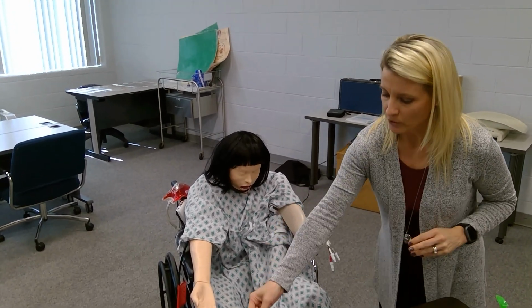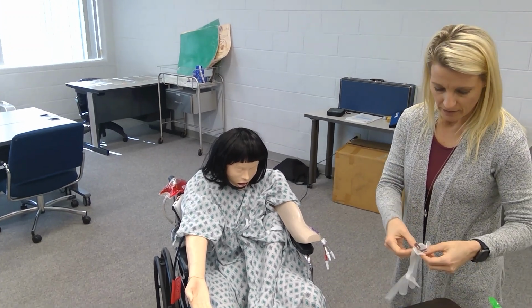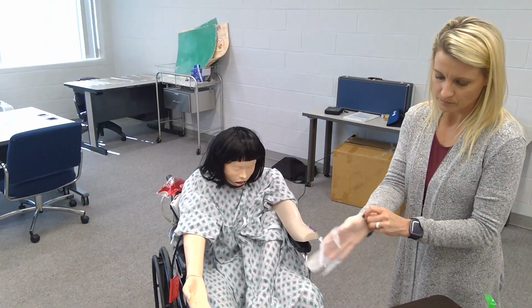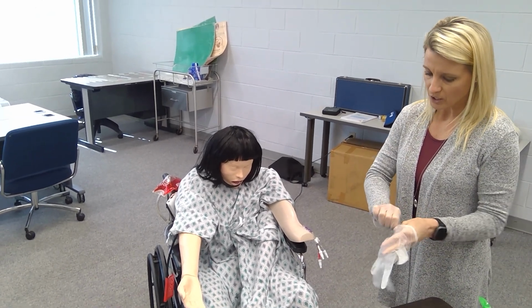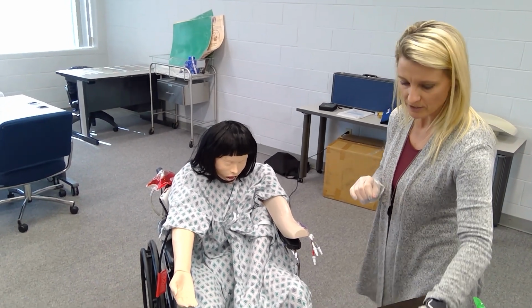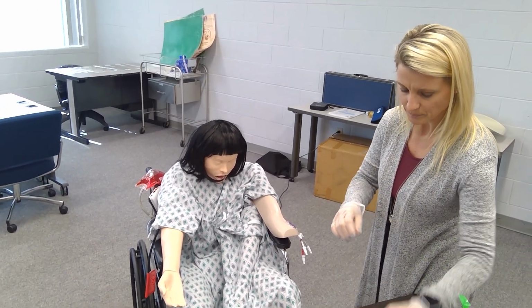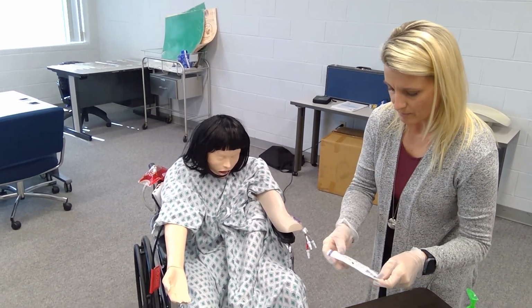Okay. I've already shut the door to provide us some privacy. I'm going to put my gloves on. No, this is not going to hurt at all. In fact, you're probably not going to feel it at all. But I'll tell you everything that I'm going to do. This is an alcohol swab. Let me go ahead and open my tubes real quick.